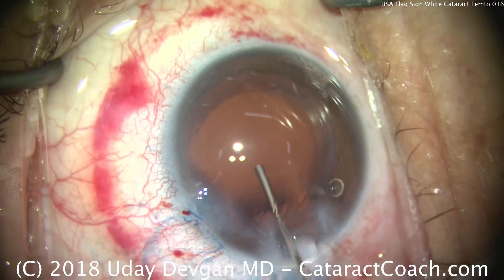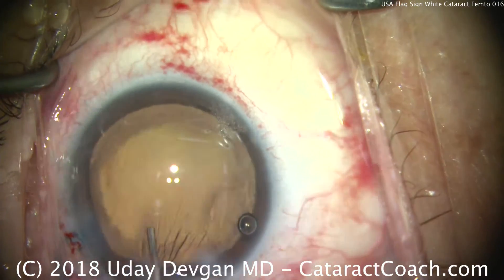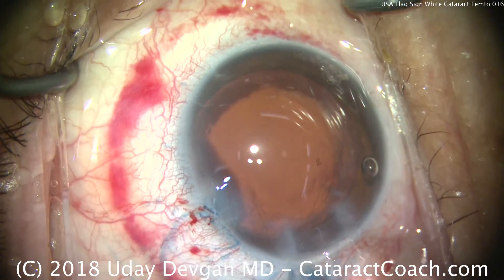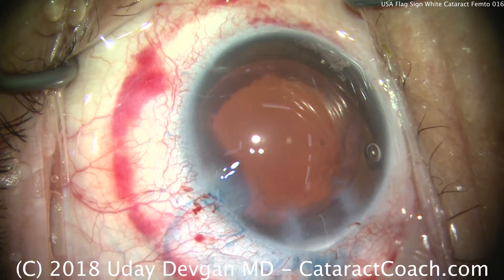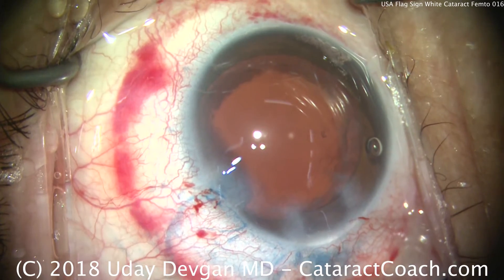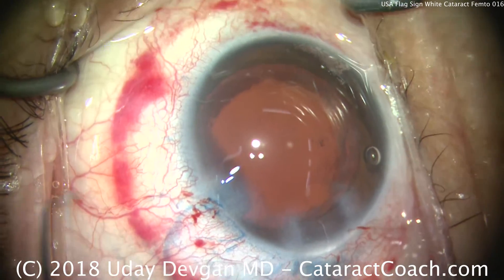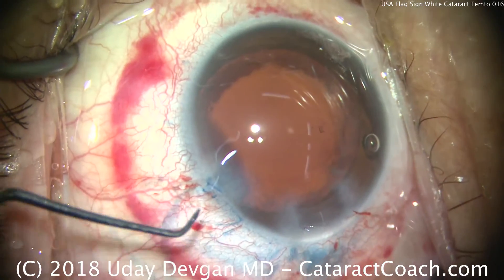The capsule bag is being inflated fully with viscoelastic — that's a nice fill. We're going to put our lens in the capsule bag. Here we're going to use a single-piece acrylic monofocal lens. Some of these patients who have white cataracts do have a little bit of extra inflammation in the post-op period.